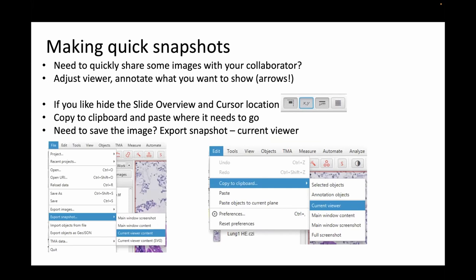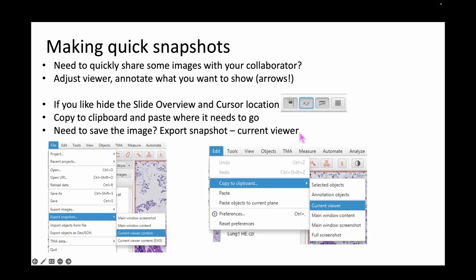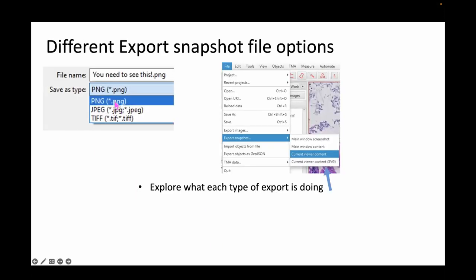Say a collaborator calls asking for quick snapshots for a presentation in 10 minutes. You adjust the viewer, annotate what you want to show — for example with arrows — hide the slide overview and cursor location if you like, keep the scale bar, and then go to Edit > Copy to Clipboard > Current Viewer. What you see on screen will be copied to your clipboard. If you need to save the image, you can go to Export Snapshot > Current Viewer — any viewer adjustments will be saved as PNG, JPEG, or TIFF.